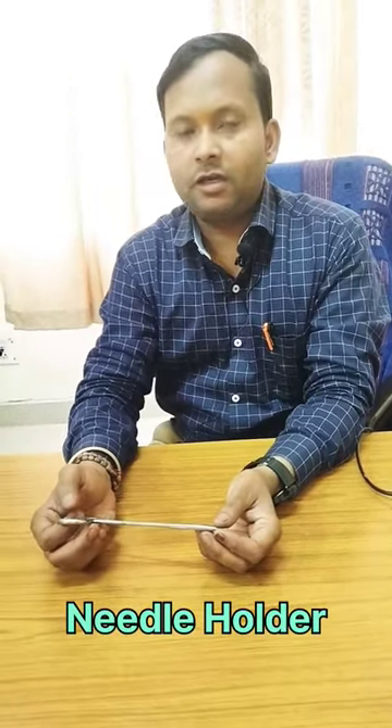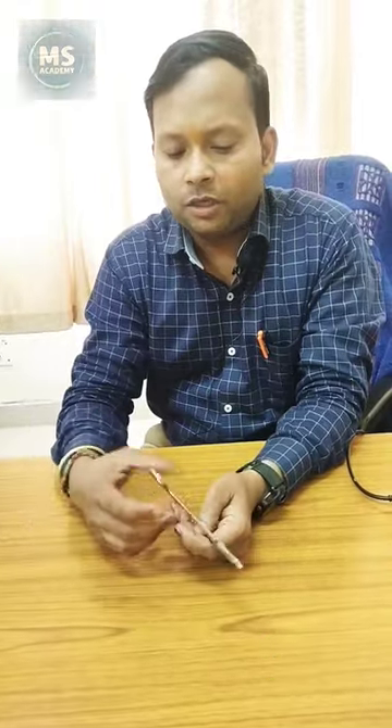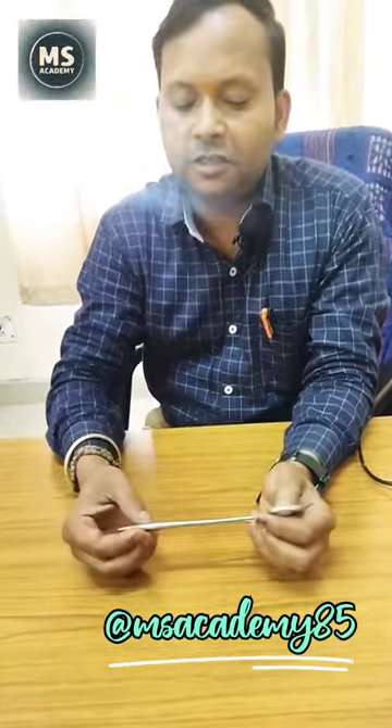Today we are going to know another instrument of operation — the Needle Holder. We will know the parts and the uses of its parts.